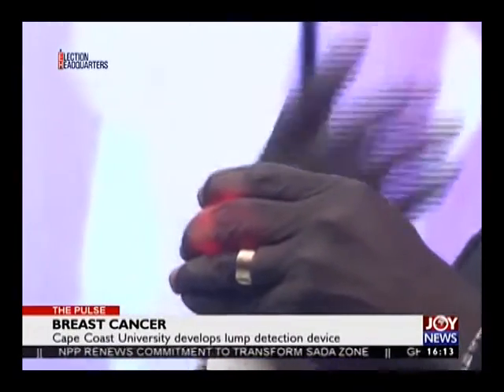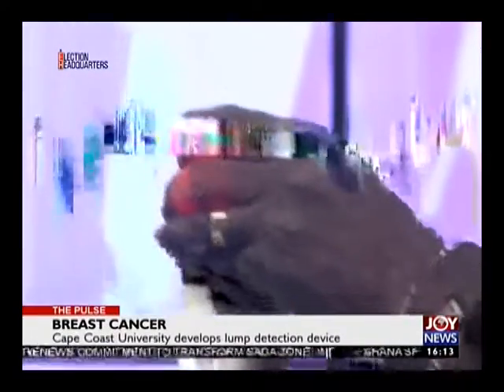Just to protect the eyes of the user. So when this happens, just for demonstration, for anyone who's watching, if you place this light under the skin, under the breast, what will it reveal? It will reveal all the blood vessels. All the blood vessels will show. Okay. Including that around the tumor, which is supplying extra blood for it to expand at the expense of the normal tissue.